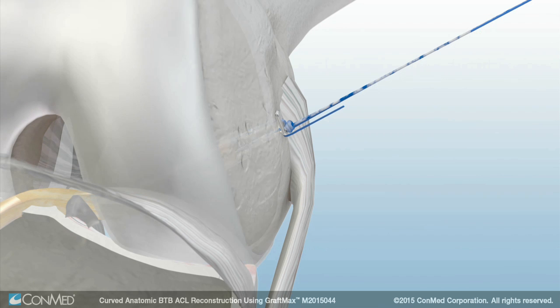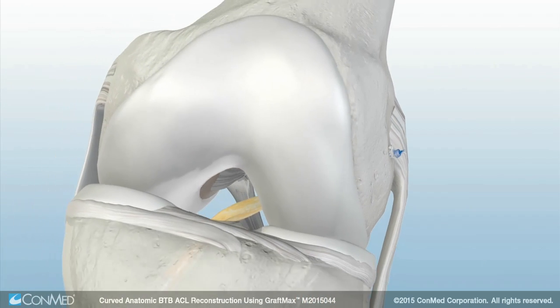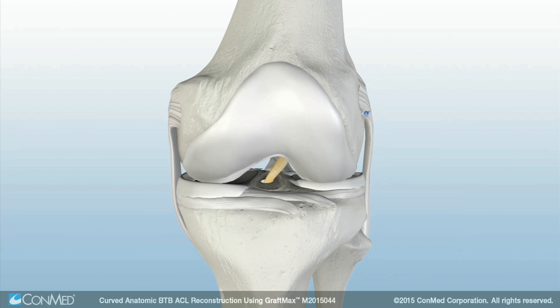Next, unthread the blue suture from the button. Trim the two strands of the striped adjustable loop tails flush to the skin with a sharp blade. Follow normal procedures to close the incisions.